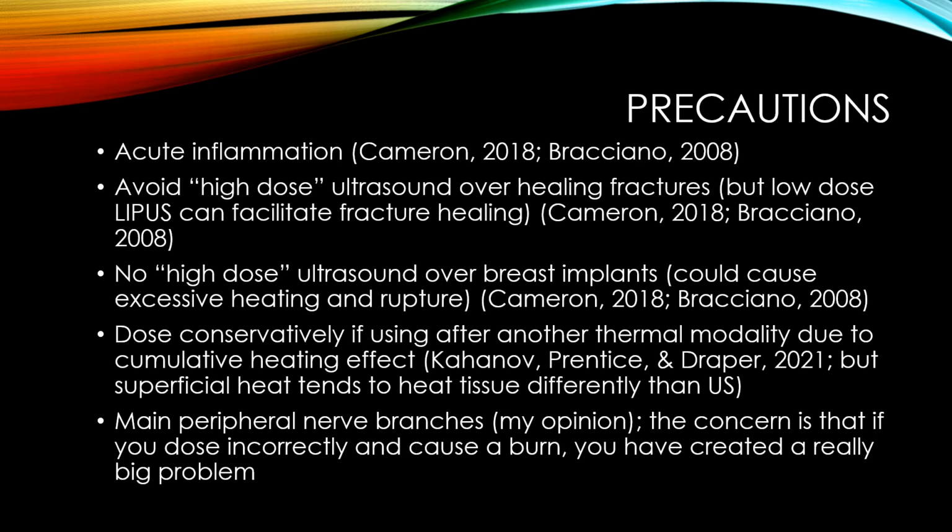So let's first look at the precautions for therapeutic ultrasound. One precaution is acute inflammation. The idea here is that if you are putting energy or heat into an area that is currently in acute inflammation, you might make the inflammation worse. You want to avoid high-dose ultrasound over healing fractures because it may slow fracture healing. However, low-dose or low-intensity pulsed ultrasound can facilitate fracture healing.